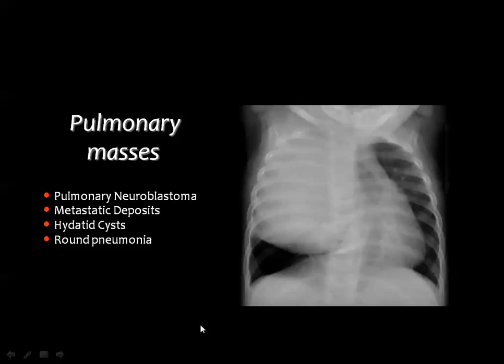One of the best ways to have this information is to do a chest ultrasound. And this chest ultrasound is very, very good in the pediatric age group, considering this differential diagnosis. You know that ultrasound is free of radiation. Ultrasound is cheaper than CT scan. Ultrasound does not need the injection of contrast material, and the ultrasound can be performed as a bedside technique. Then it is a reliable diagnostic way to separate the solid from the cystic masses.